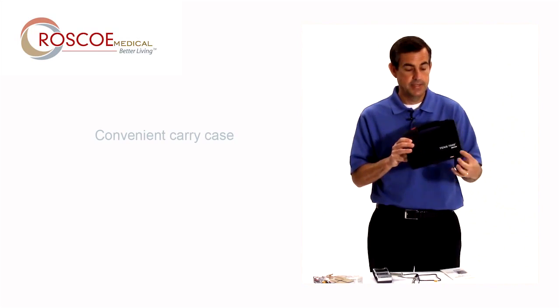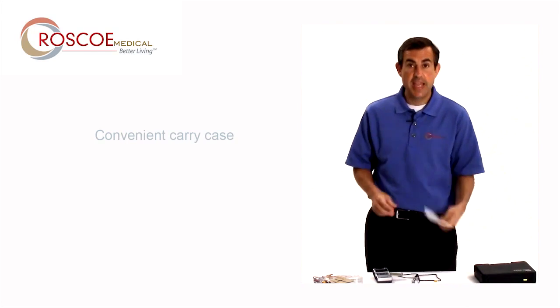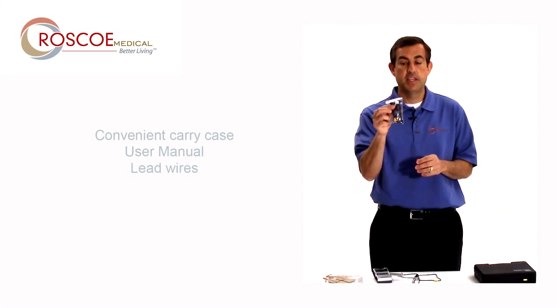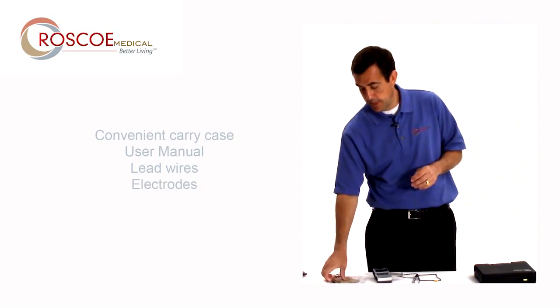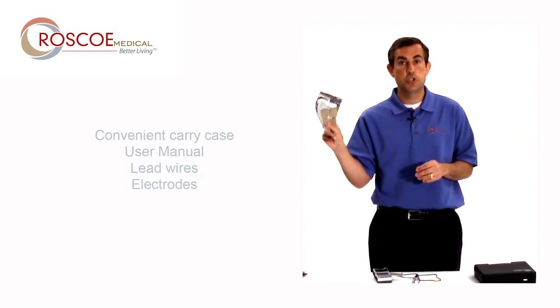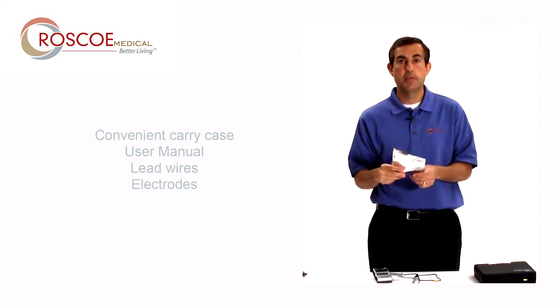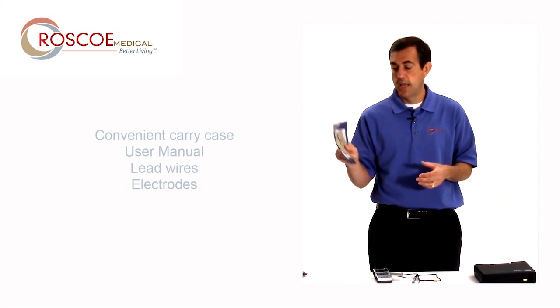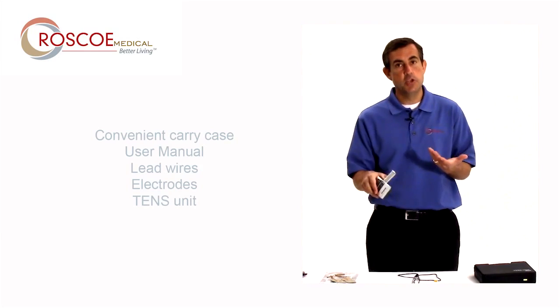It comes in this black case — TENS 7000. Comes with a user manual, one set of lead wires, and one pack of starter electrodes. Important to remember that these are just starter electrodes. For more electrodes, please visit your authorized Roscoe Medical dealer or your physician. And then obviously the unit itself.